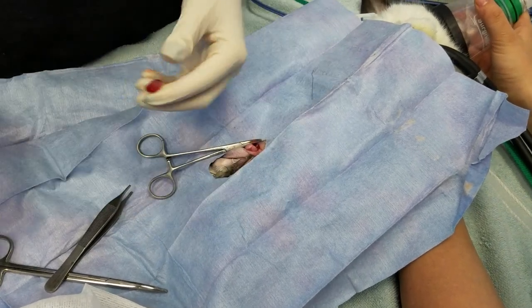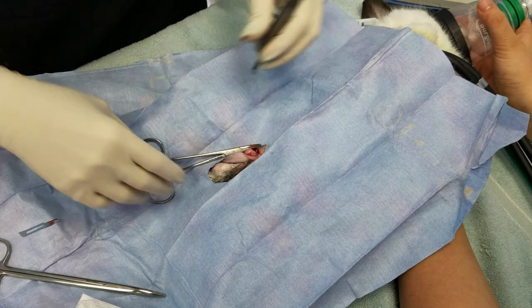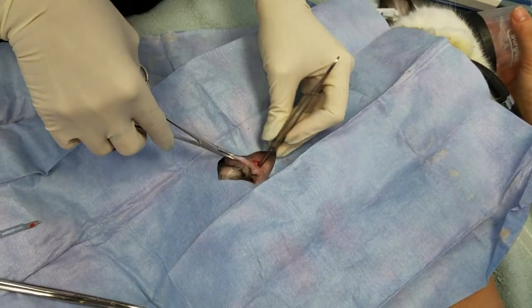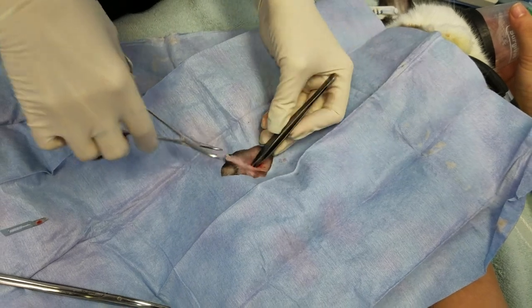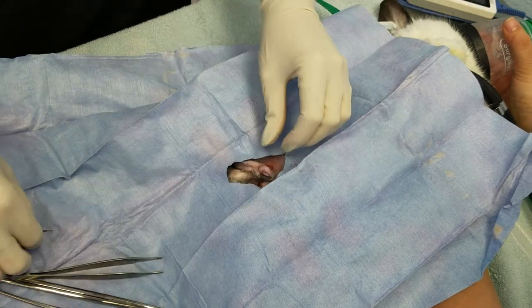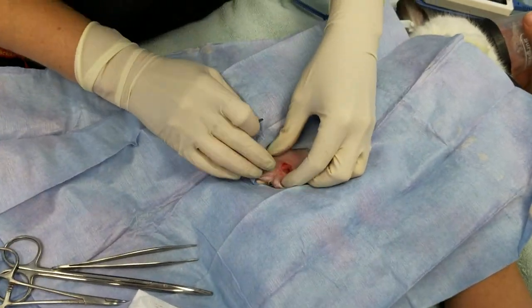And remove our testicle. Check our pedicle for bleeding and then replace our inverted scrotum. Now on to our second one.